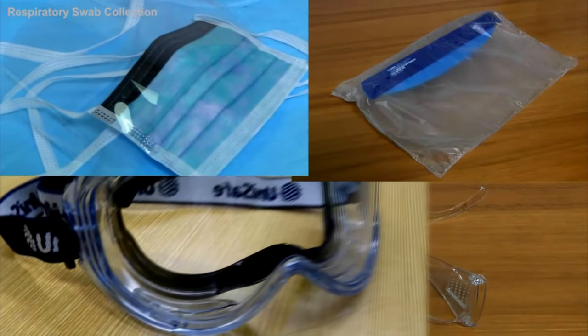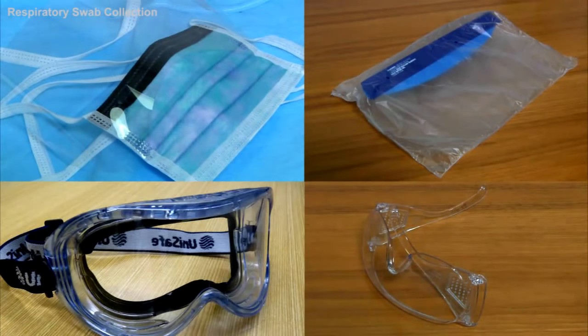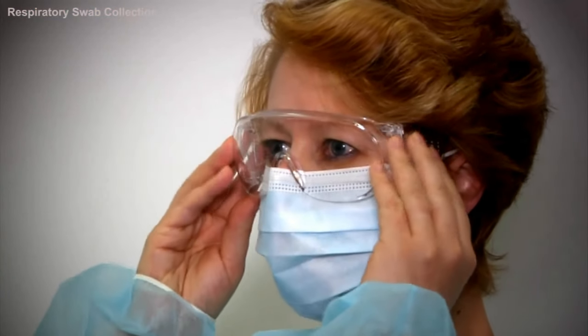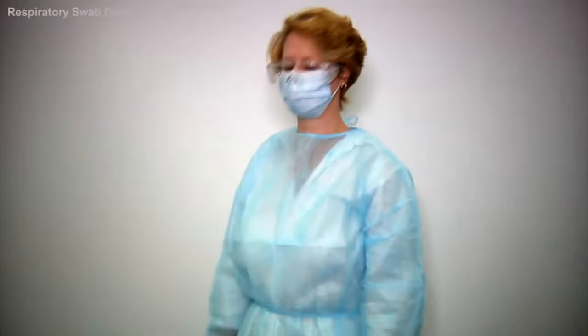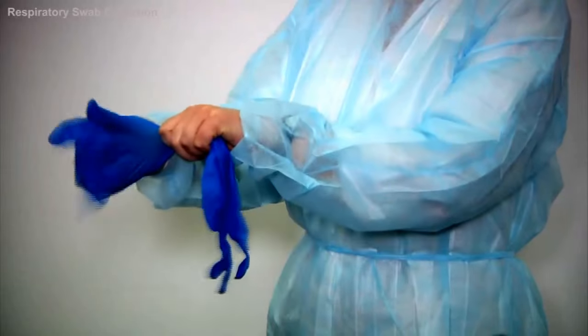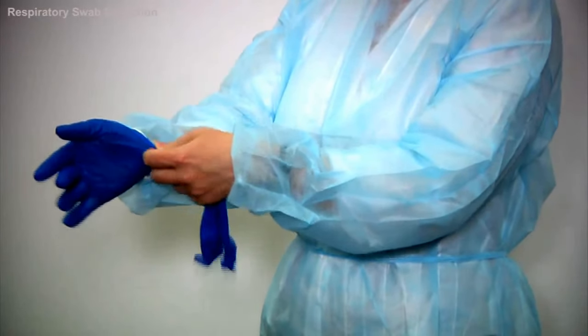Next, select appropriate protective eyewear according to the relevant guidelines and place the eye protection on, ensuring a good fit. Finally, put on your gloves, ensuring that the gloves are the correct size and are placed over the sleeves of the gown as demonstrated.